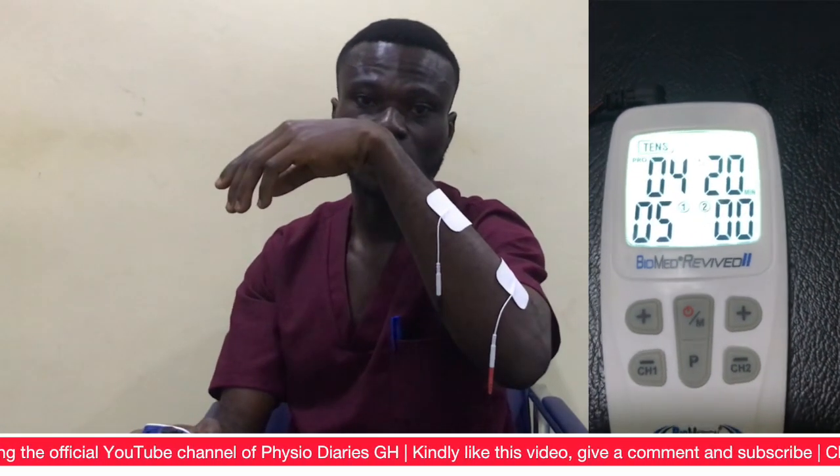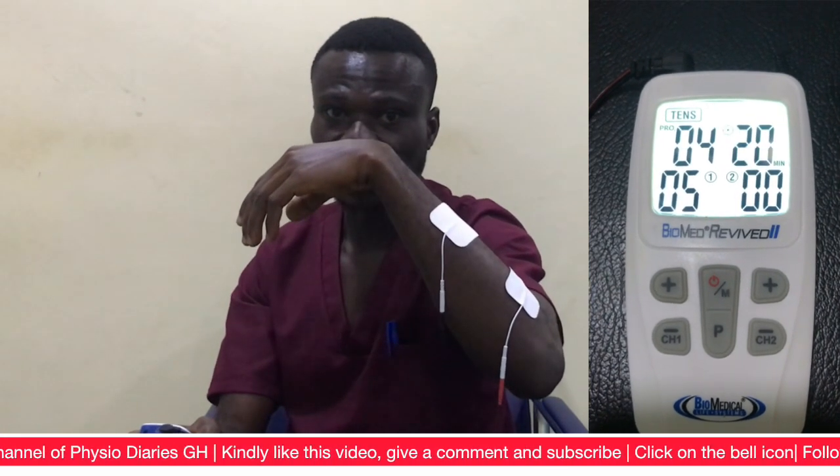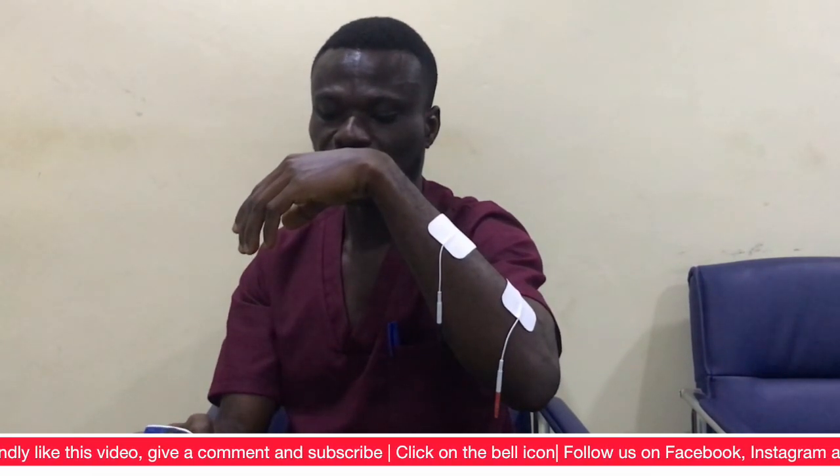I want you to watch the wrist. Let me keep it in the position just like the patient will present, so we can see whether we achieve wrist extension. I'm going to increase it to five — five is optimal because higher can be very uncomfortable. You need to find a comfortable position for your patient to relax. Let me put the hand down and it will go again.